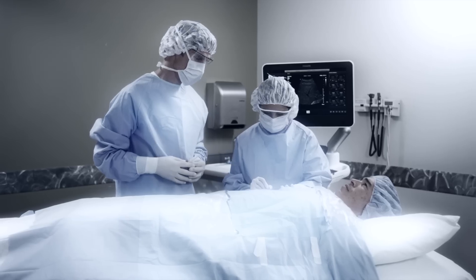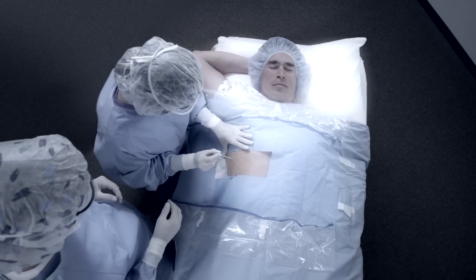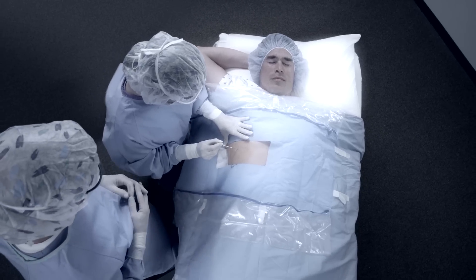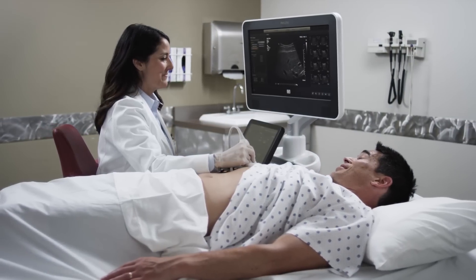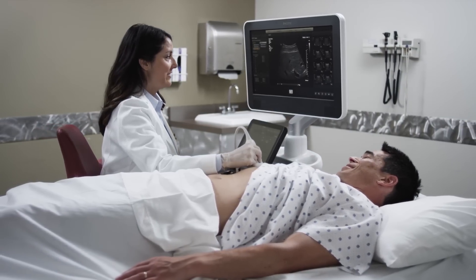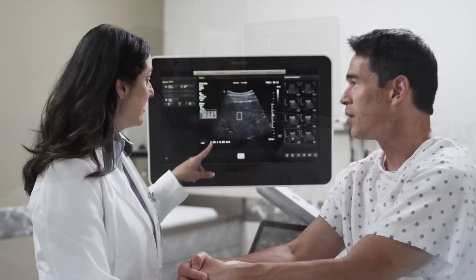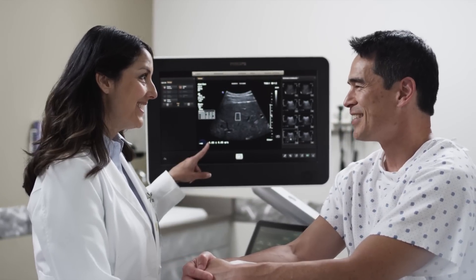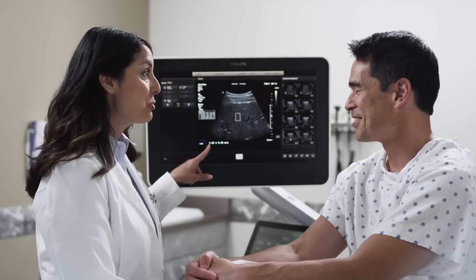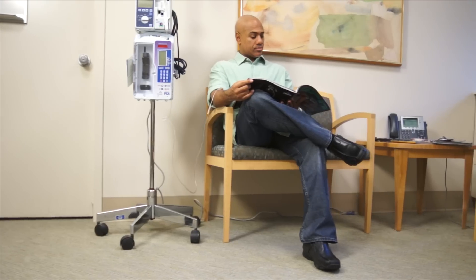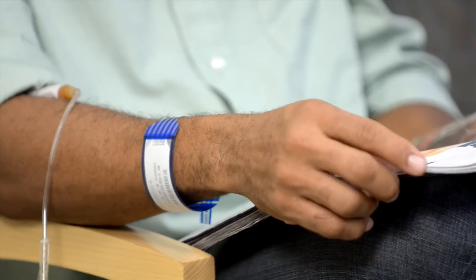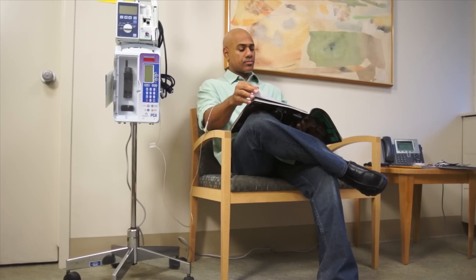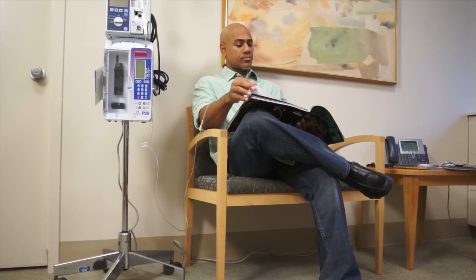Philips ShearWave Ultrasound Elastography can turn what normally is a costly, invasive, painful procedure into a simple, easy, painless exam. It helps clinicians assess the progression or reversal of the disease, and it makes a cost-effective approach to help clinicians assess patients who are undergoing potential hepatotoxic therapies.